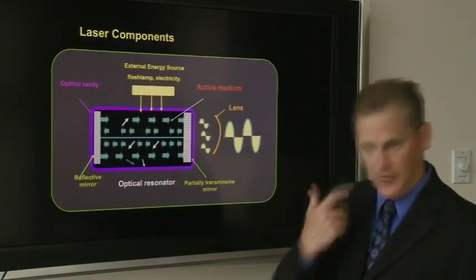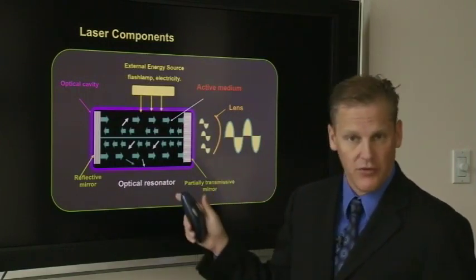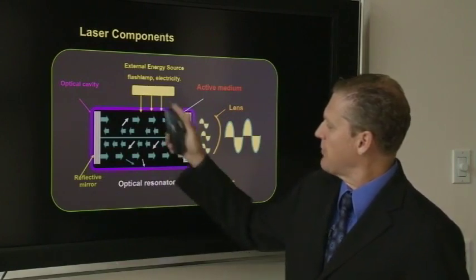When you look at the inside of your laser and you were to look at the components of the laser itself, one key thing you'll see in all lasers is an optical resonator.